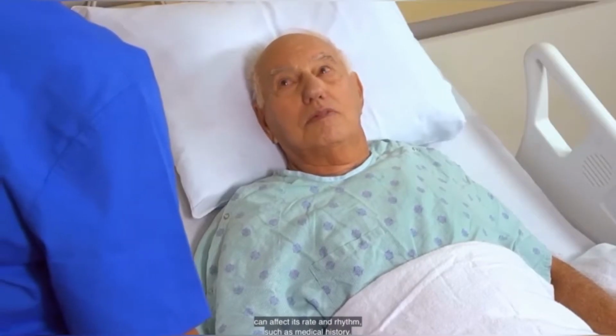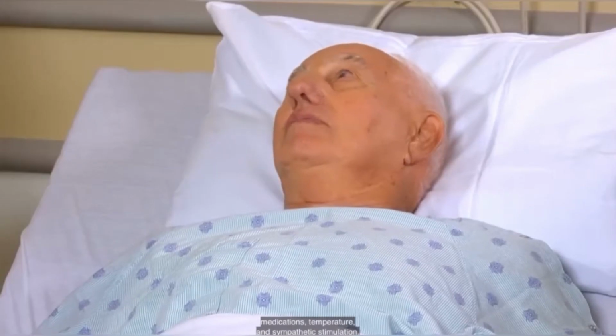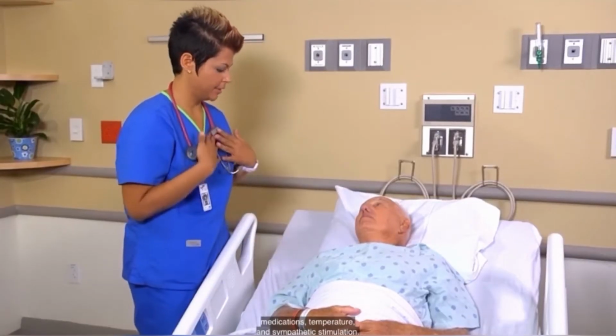To take the apical pulse, begin by assessing for factors that can affect its rate and rhythm, such as medical history, disease processes, age, exercise, position changes, medications, temperature, and sympathetic stimulation. Okay. Well, we're going to get started. I'm going to take a listen to your heart rate, okay?